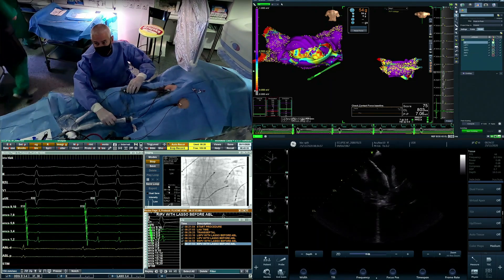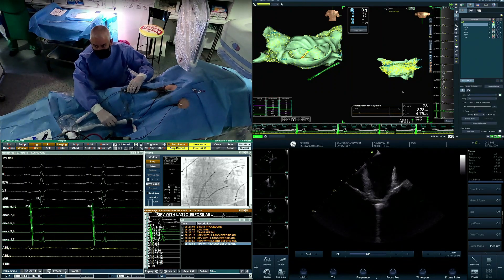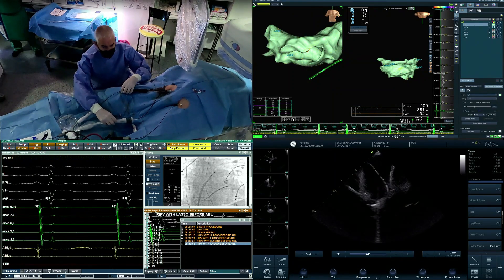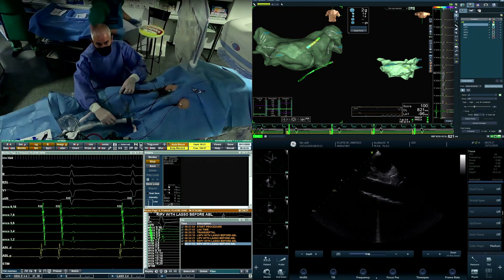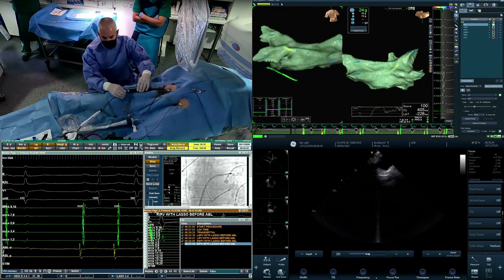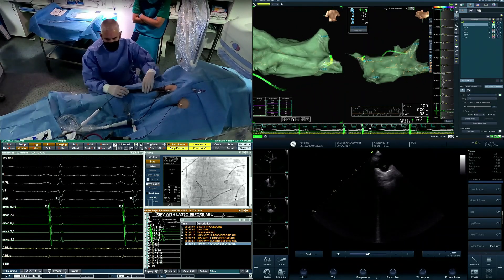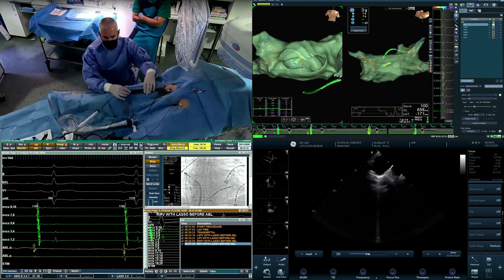This is typical for any Navix-assisted procedure, and especially here since the PFA application per se can interfere with the principles of how the system works. Later on, as we will show, when patients start coughing — which is also intrinsic to any PFA platform, especially around left superior veins — the map tends to be unstable or shift. Here we are showing that we're going to improve our map by entering all the PVs with the ablation catheter, then the technician will lock down the geometry and prepare for ablation.